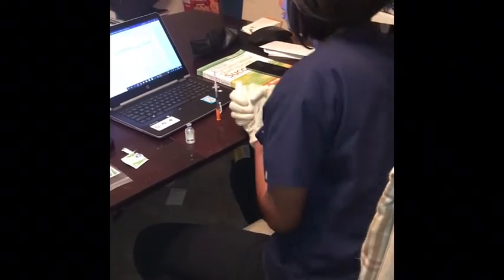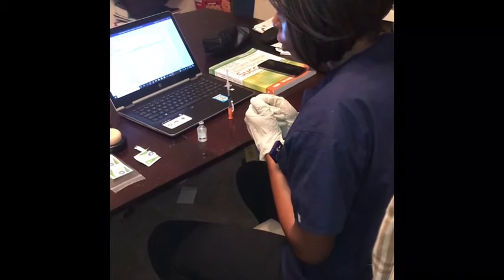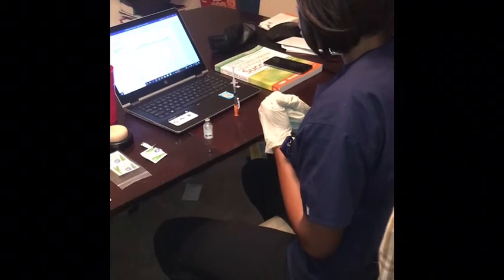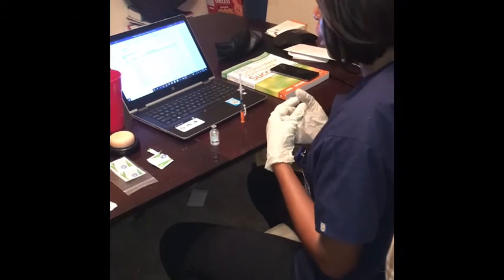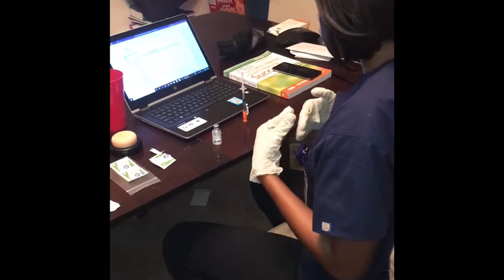And then after this part, I'm going to go into my patient's room and do my third check in the patient's room. I'm going to select the body part for the injection. For right now, I'm going to do the injection in the abdominal area for my client. So I'm going to bring in my client. Hi, my name is Miriam, and I'm going to be your nurse for today. What's your name? Jan Doe. What's your date of birth? 1/23/27. Okay, let me confirm that.